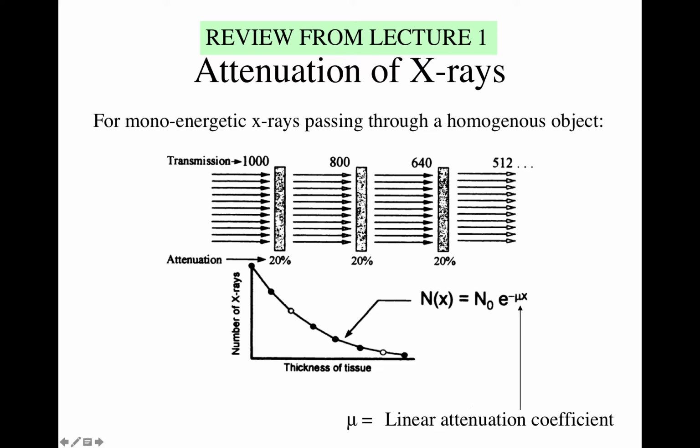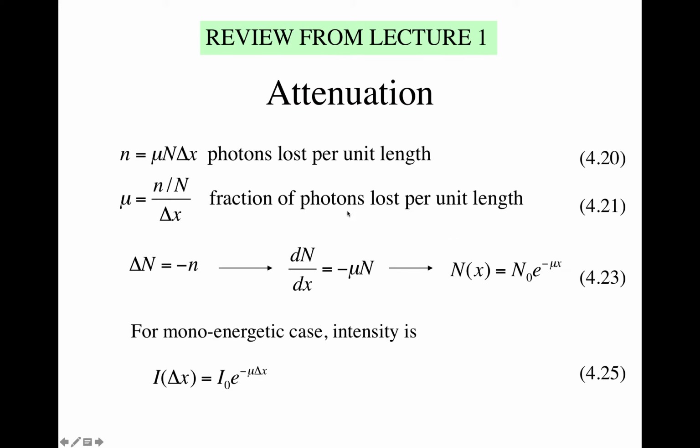So this again, we looked at this diagram before. If I have X-rays hitting this material, 20% are absorbed by the material, and you plot that, it fits very nicely a mono-exponential decay, where this is the characteristic of the material itself. If you want to derive it, in the book, Dr. Prince et al., they derive this equation from first principles if you want.